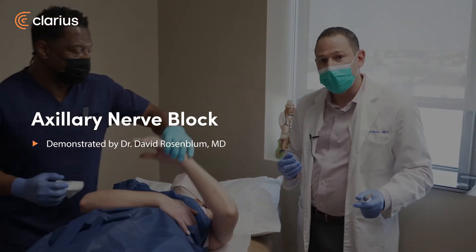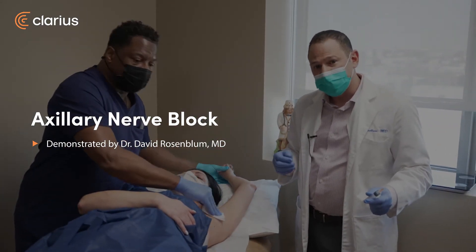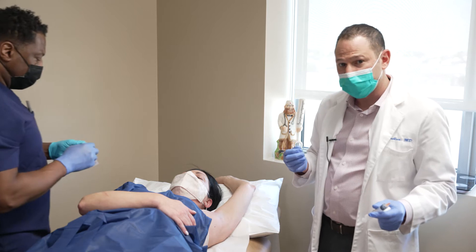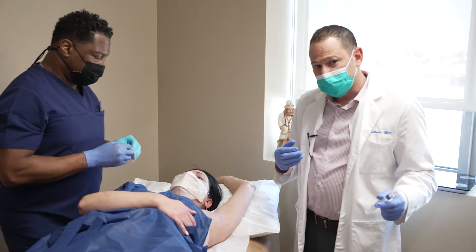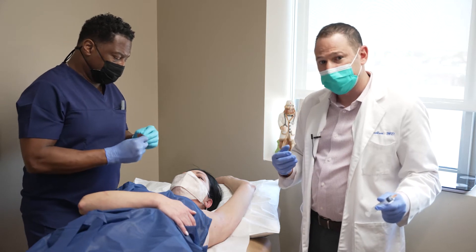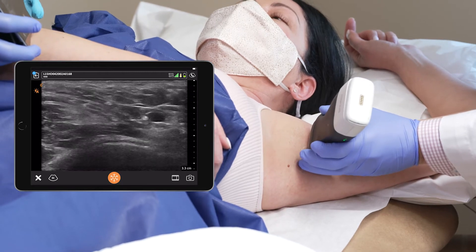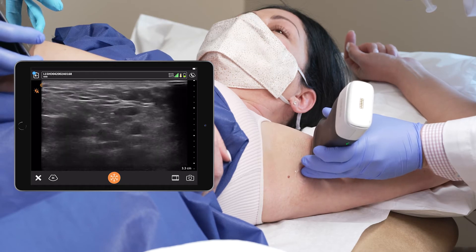The patient suffers from cervical radiculopathy manifested as pain from the axilla down to the fingers. The original radicular symptoms were alleviated with the previous shot, in which we did a selective nerve root block. Today she's presenting with pain in the axilla and the ulnar distribution because her radiculopathy is from C8. So now we're doing an axillary nerve block to get pain that emanates from the axilla down the hand.